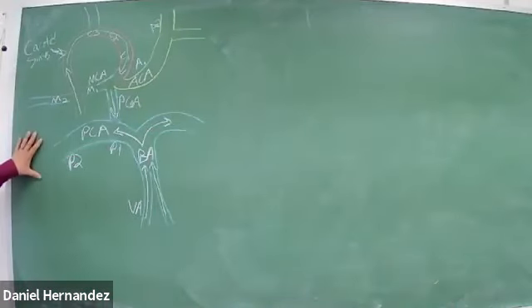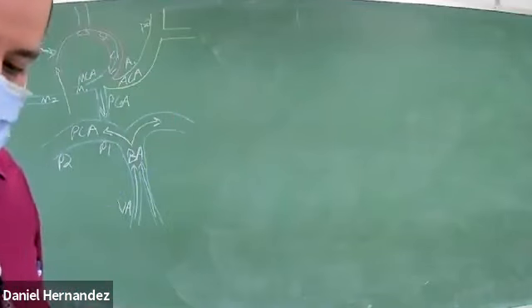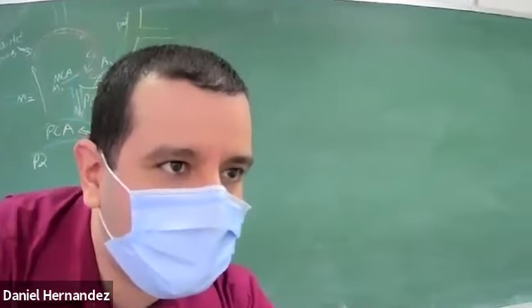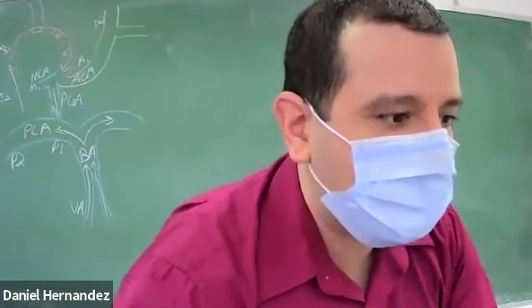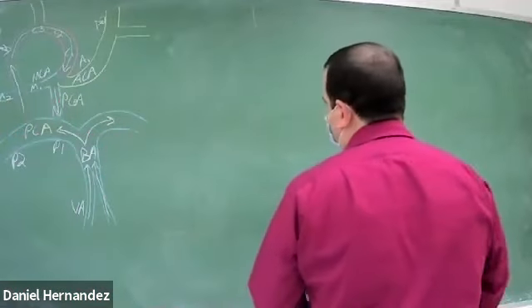If you could draw this out and understand the circulation and the direction the blood flow is going in, it makes your transcranial exam much easier because you know what the normal flow directions are going to be. It'll help you anticipate the depth of the vessel as well, because those are the two main criteria when we're doing our transcranial Dopplers. We need to know the direction and the depth in addition to the velocities that we measure. So we have four main windows that we utilize for our transcranial Doppler.